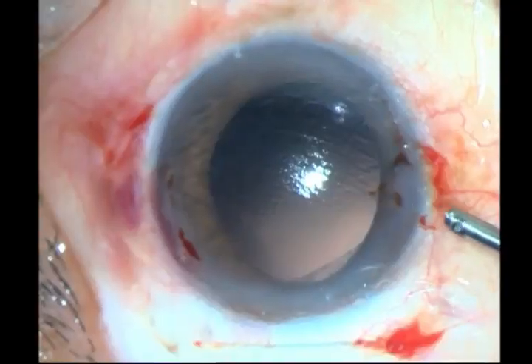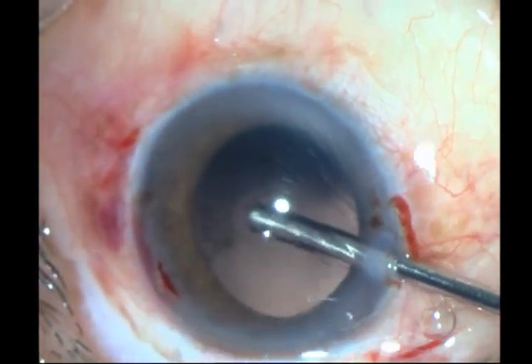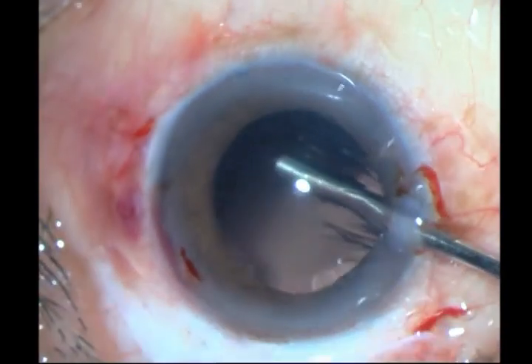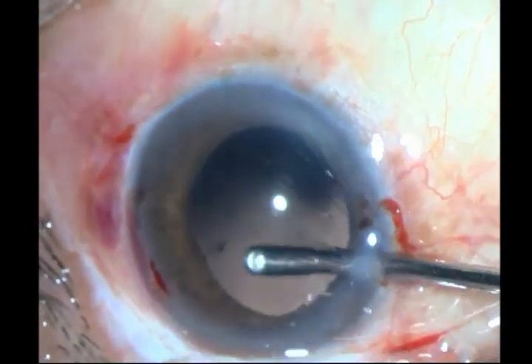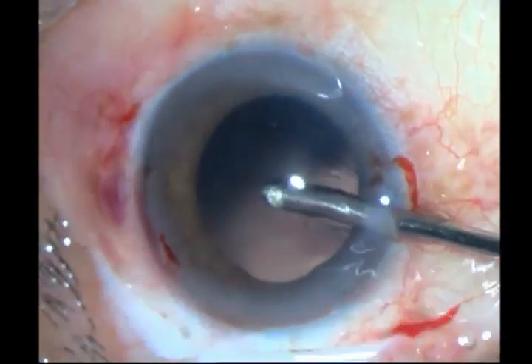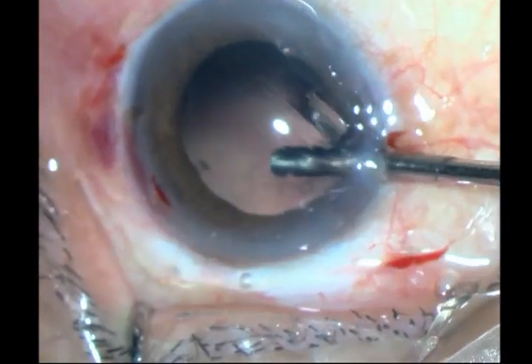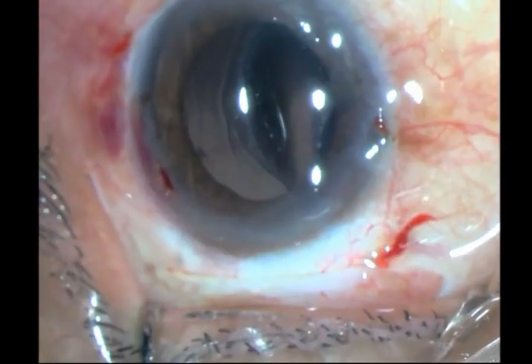However, I am not taking any chances. I am going ahead and doing a vitrectomy because once I put in my scleral sutures I am going to be disturbing the vitreous quite a bit. So I go ahead and do a bit of an anterior vitrectomy. I cannot do a complete vitrectomy like retinal surgeons do, but I think this is enough.